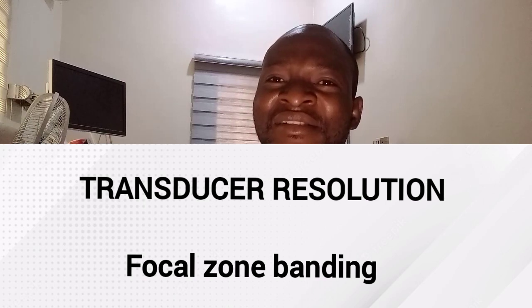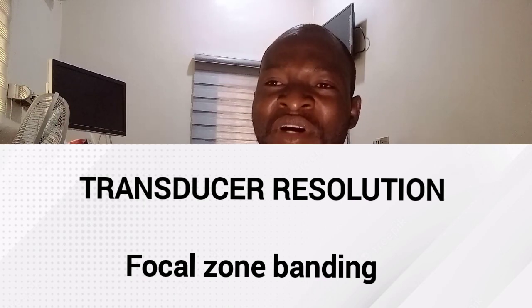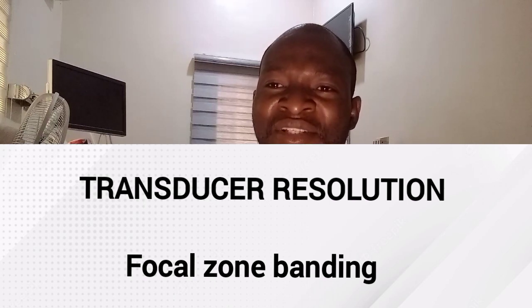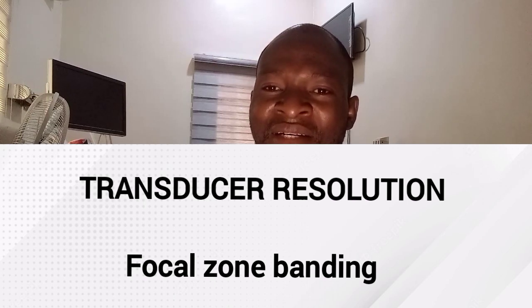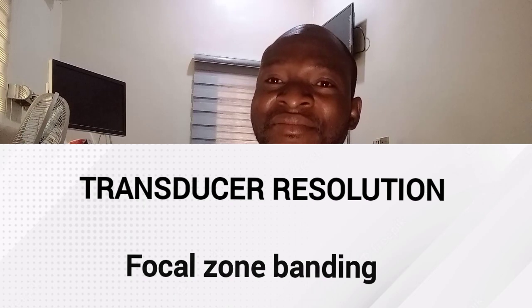That's the focal zone banding. Focal zone banding is a display of increased echo brightness in a narrow zone that is related to increased intensity of the focal region of the beam. This phenomenon is commonly seen in the liver, since the structure is large and encompasses both the near and far field of the sound beam. Focal banding can be reduced or avoided by proper setting of the TGC by the sonologist.